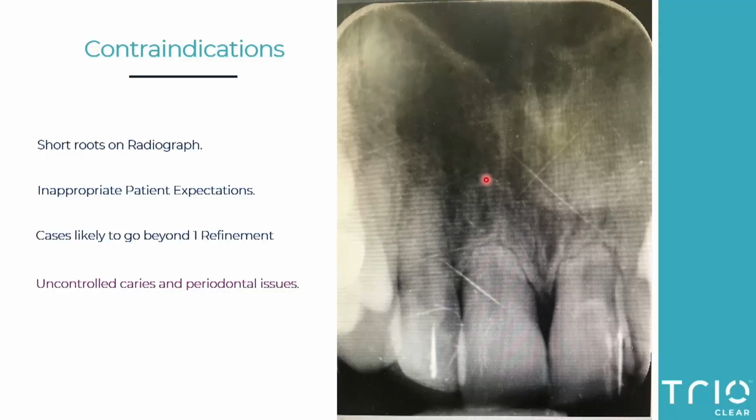So there's a lesson here regarding taking x-rays. For sure, I nearly always supplement my radiographs on clear aligner cases. If you take an OPT, they're good, but sometimes you can lose a little bit of focus and clarity on an OPT, so I nearly always supplement them with an IOPA. And I've never regretted it. They're really important. We do still observe quite a number of cases coming in through the TrioClear platform without x-rays, and we always make an assumption that they are taken somewhere but just not uploaded. But please do take an x-ray on all your cases. It's really important.